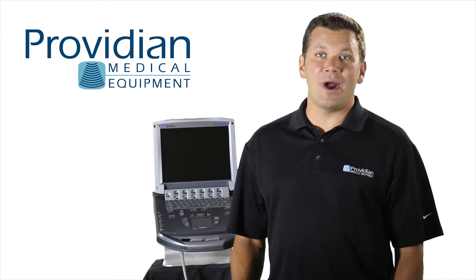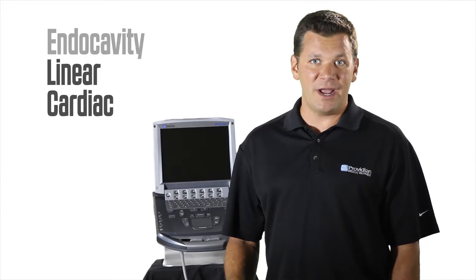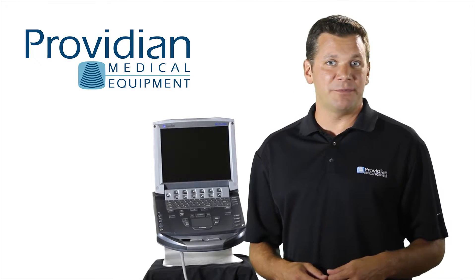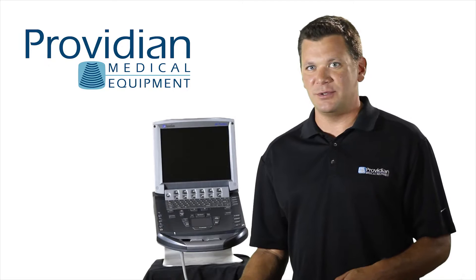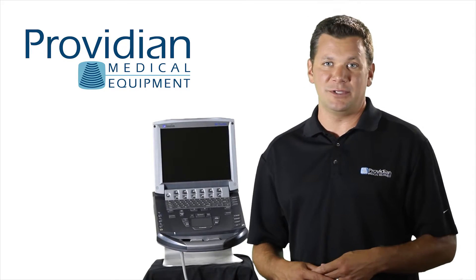The M-Turbo can run a variety of transducers including convex, linear, cardiac, phased array, micro convex, and a multi-plane TEE. It also uses internal flash memory which makes it better as a portable unit and reduces its overall weight. There's an optional cart with a triple connect transducer available that allows you to connect three transducers for situations where you're using multiple probes.